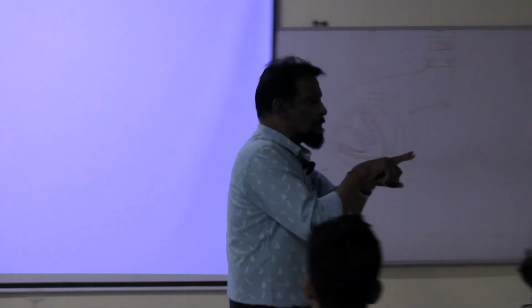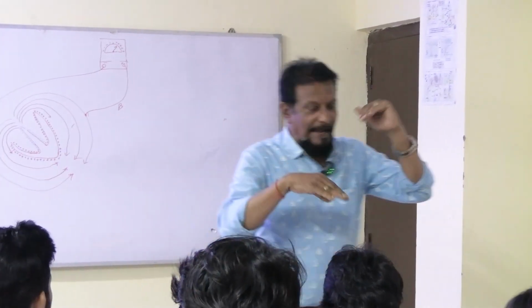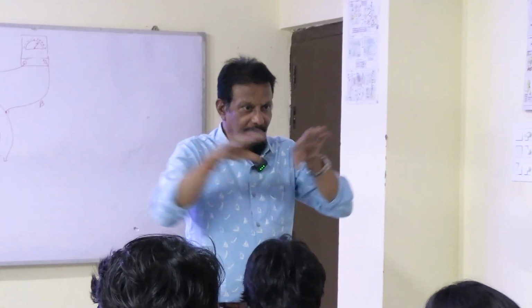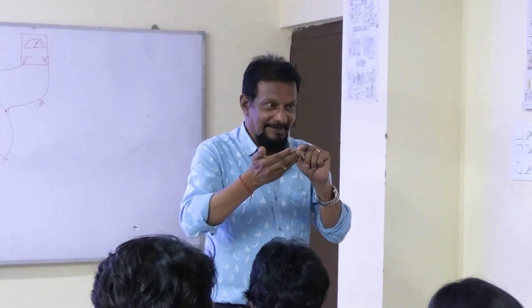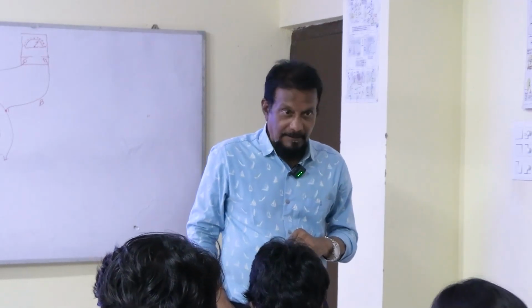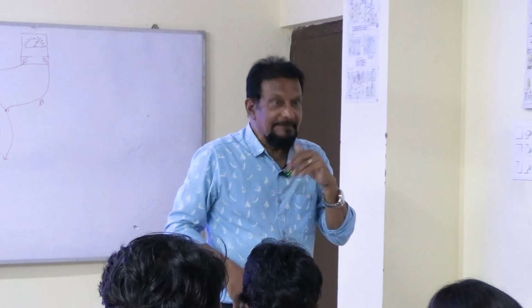What will we be analyzing? Some waves will be positive waves. What are positive waves? There will be one baseline, the zero line, neither positive nor negative. This is the isoelectric line, so it is called the baseline. If some wave is above the baseline, that will be called a positive wave, and if some wave is below the baseline, it is a negative wave.